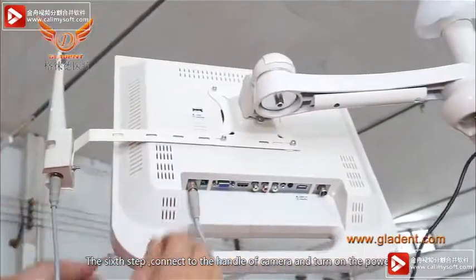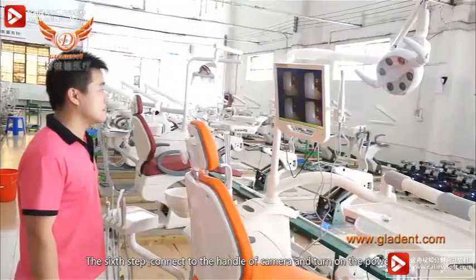The sixth step: connect the handle of the camera and turn on the power.